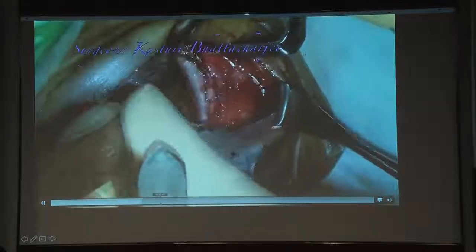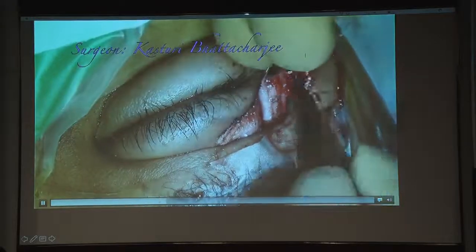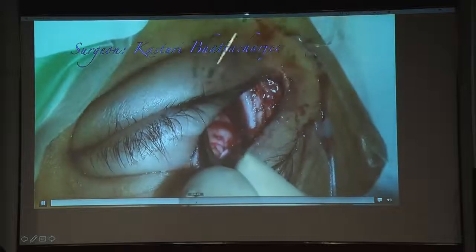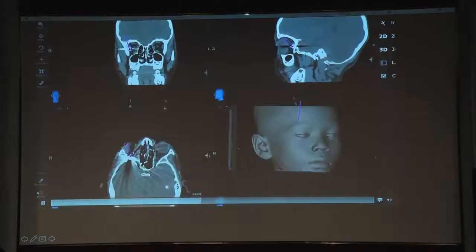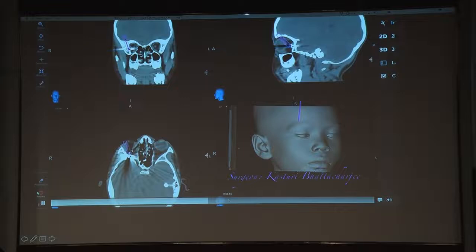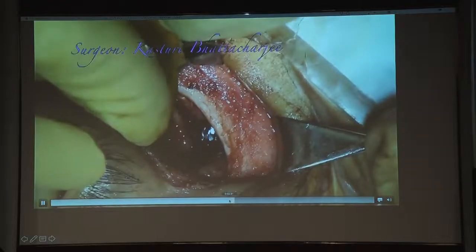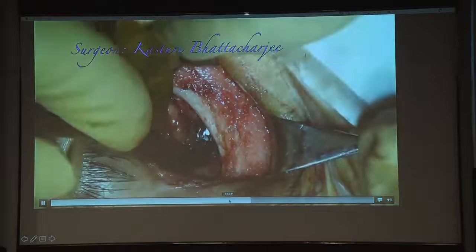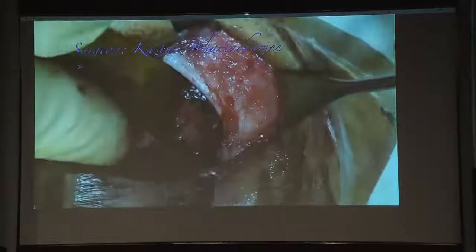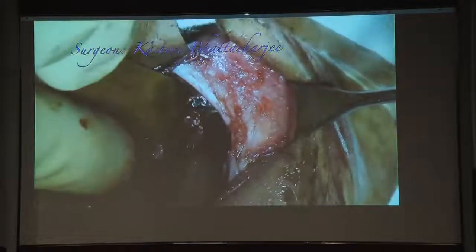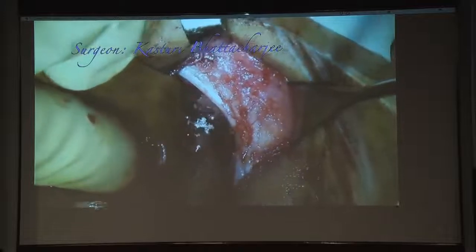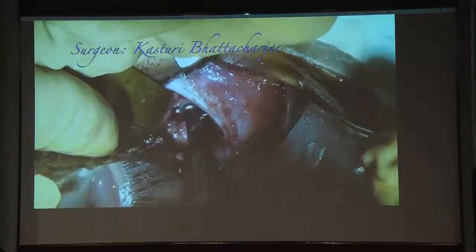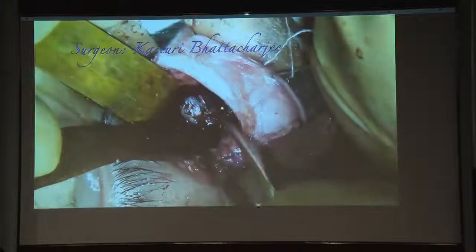Using the navigation stylet for direction, I reached the foreign body but found it totally stuck in the greater wing of the sphenoid. Simply pulling it out risked injuring cranial structures behind it. I used a drill to create space around it, loosening the bone edges, and only then could the foreign body be safely removed.